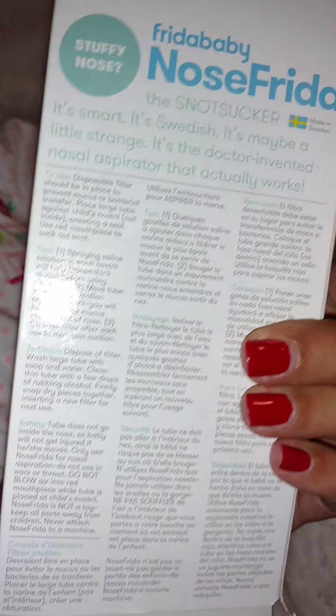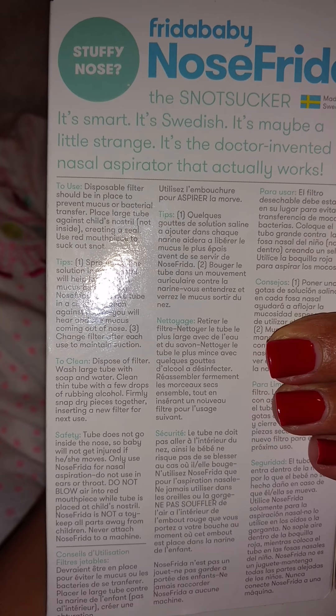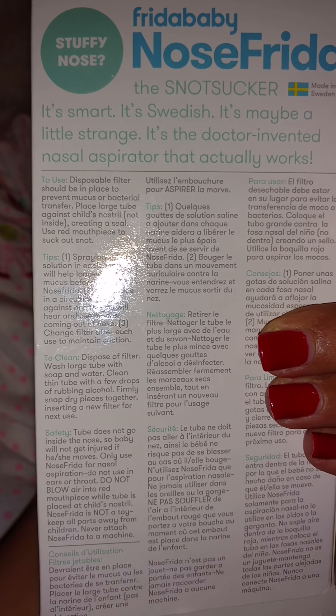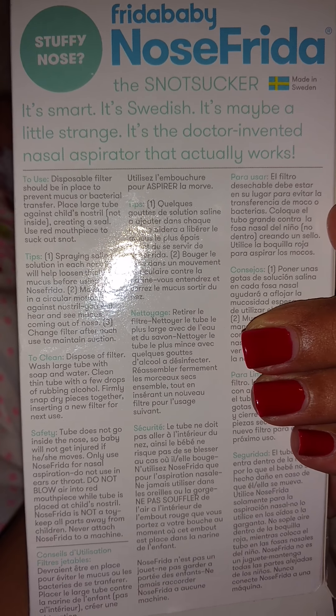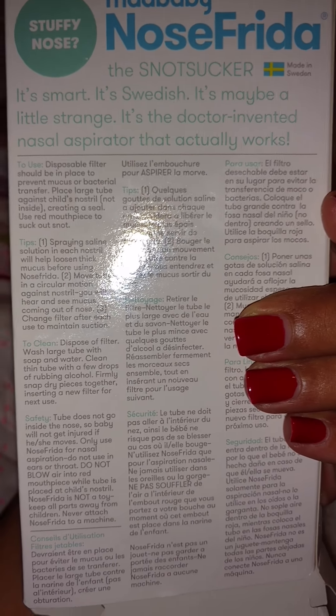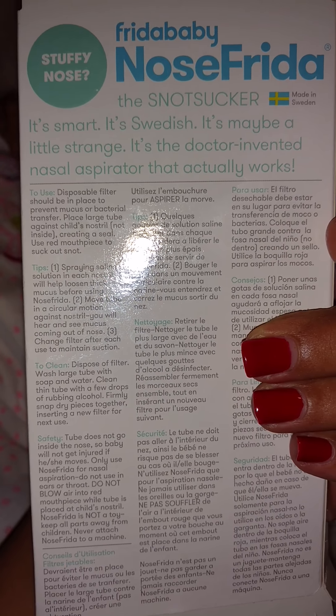It's going to be our first time using the Nose Frida. So I just read the directions really quick. It says to use disposable filters, which should be in place to prevent mucus or bacterial transfer. Place the large tube against the child's nostril, not inside, creating a seal. Use the red mouthpiece to suck the snot out.